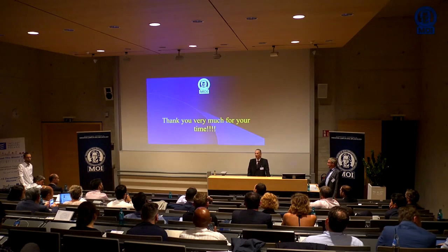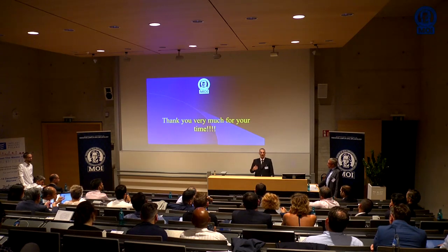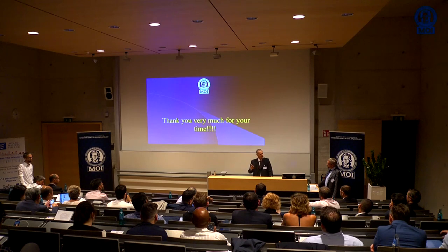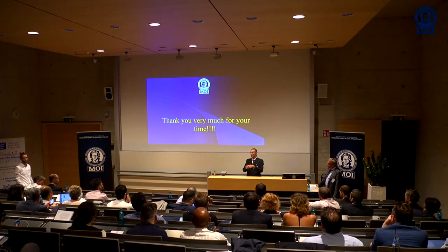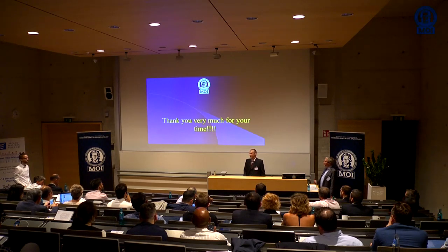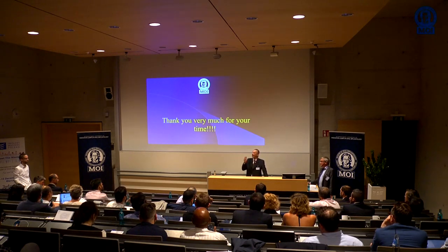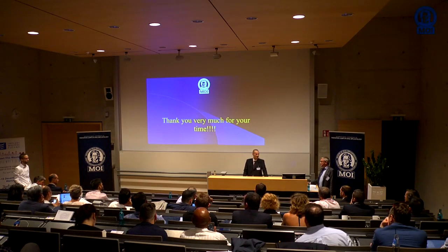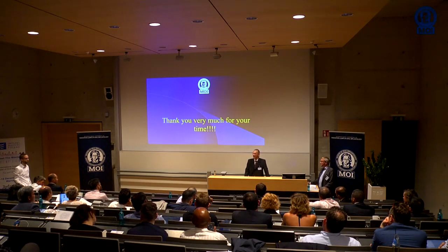That's a very good question. My concern about having enough bone on top of the tip of the implant started when I started working with my ENT colleague, the one who fixes the sinus when we have problems. In those cases the sinus membrane is extremely attached to the tip of the implant and the patient gets infectious sinusitis, the surface of the implant becomes a harbor, a nest for permanent infection in the patient. So nowadays all the ENT specialists are not happy with what we're doing in the sinus, because once the patient gets an infection, it's almost impossible for the patient not to have repeated sinusitis.